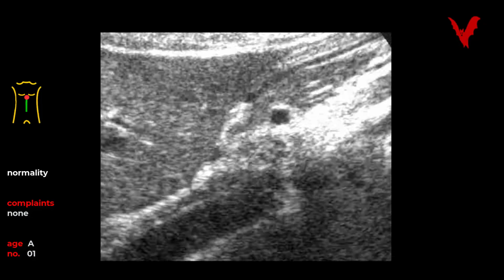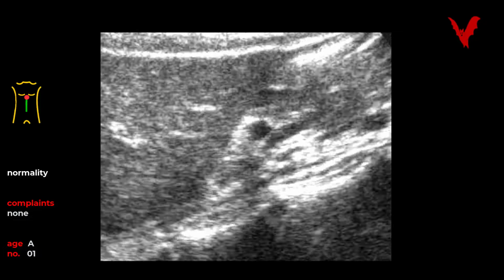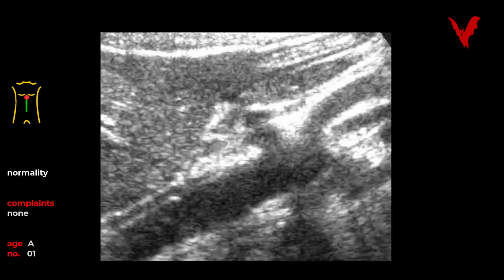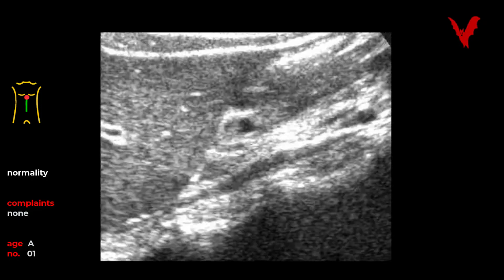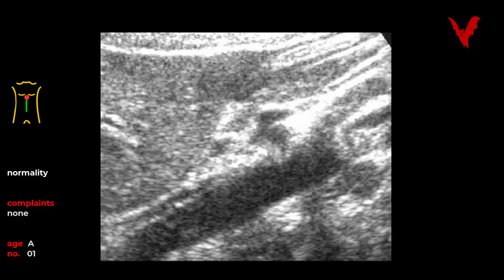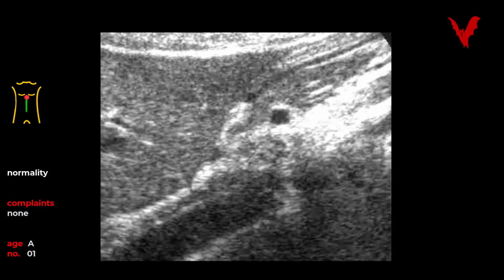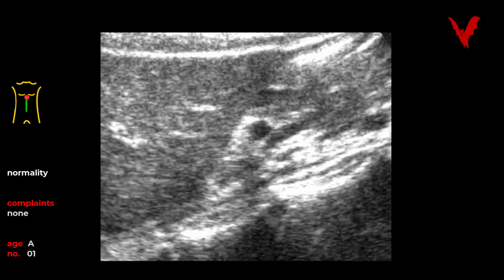As a considered choice of examples, as normals in figures 1 to 6, we have chosen some special cases. And third, measurement of the liver is doubtful. There are no normal values.